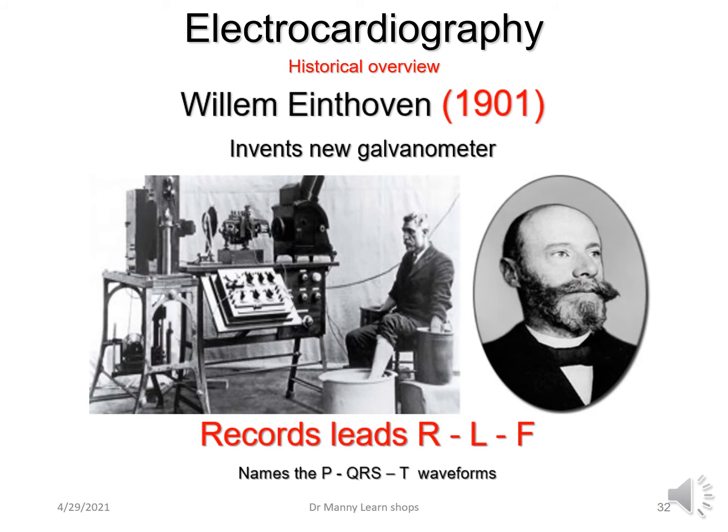Let's review some of the history related to electrocardiography, and it's brief. I haven't included absolutely everything. However, it was Willem Frans Einthoven in 1901 who invented the ECG machine, referred to as the EKG machine in German. And he recorded right, left arm currents from the heart and from the foot.